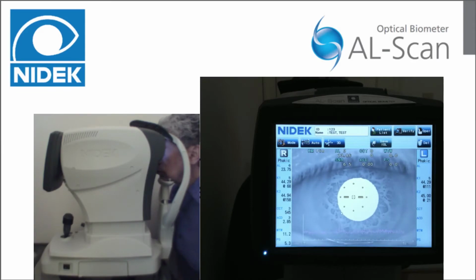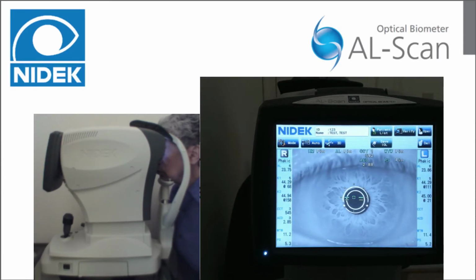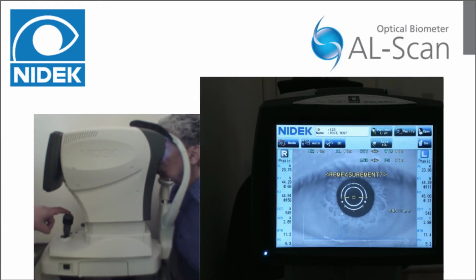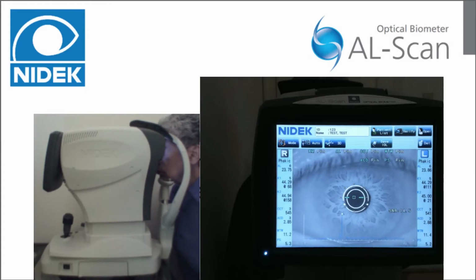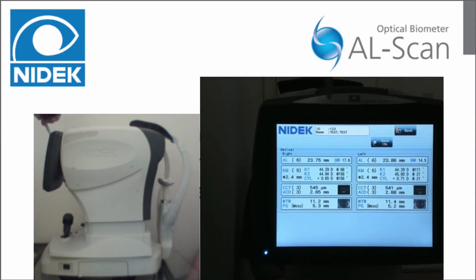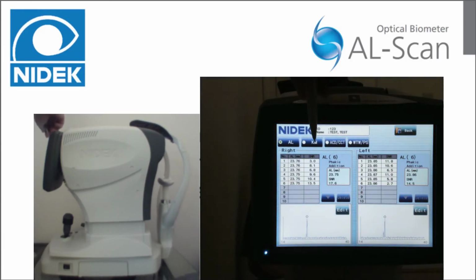Press the Verify button. Check the details of the measured result and ensure they are satisfactory. Improper data can be deleted. However, after the measured data is saved, the finalized data cannot be deleted. Press the Save Output IOL button.